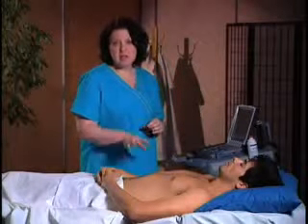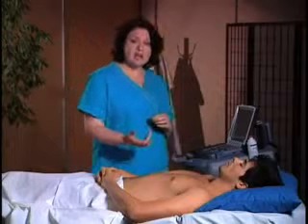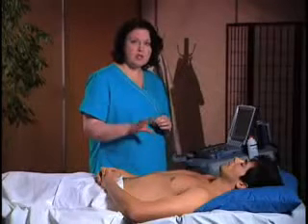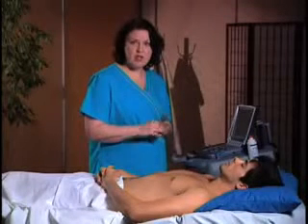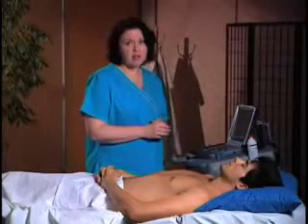doing the subcostal or subxiphoid view. The parasternal long axis is a great alternative to get an overall estimation of function of the left ventricle as part of the FAST exam, and also evaluate for pericardial effusion.